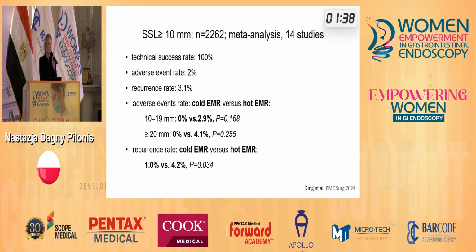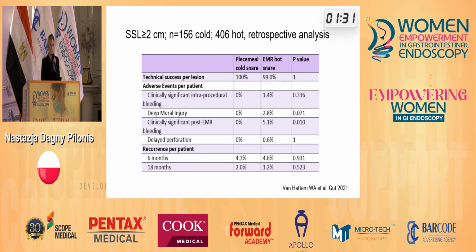I think this is something we have to keep in mind, that cold snare polypectomy here could be beneficial. What about those large lesions?